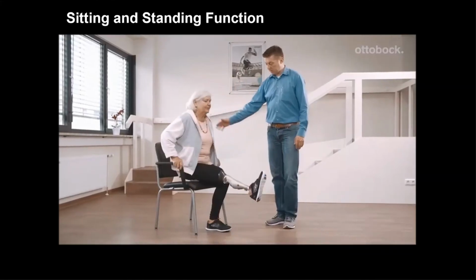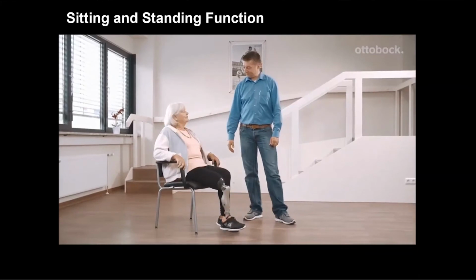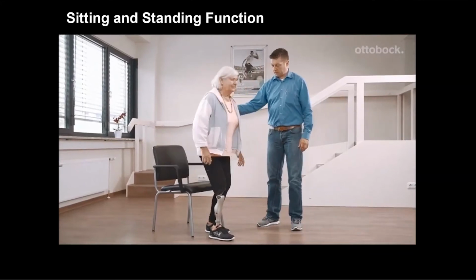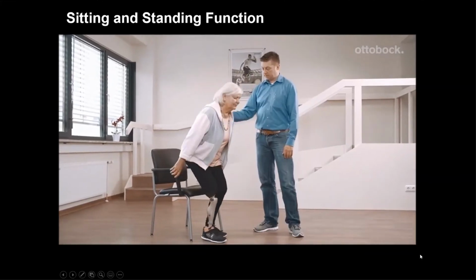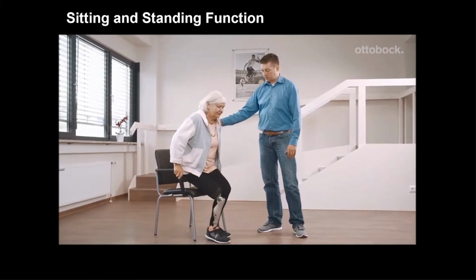So here I'm going to show you a video of an individual using the sitting down function in the A mode. So in this particular case, the knee was locked and she doesn't even use the knee, but when the knee is in a fully extended position, after a couple seconds, it releases. And then you can see in the standing up position that she goes to get to the 45 and then it will lock. And then sitting down, she can lower herself down into the chair.